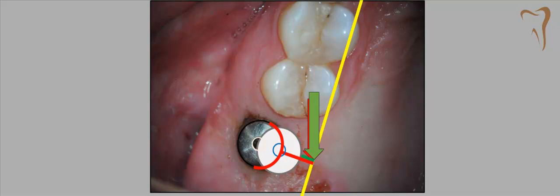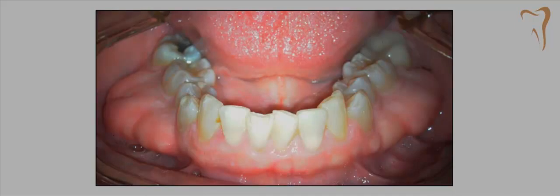So I don't think this is my research here. But when you look at it and you put the implant back into the middle of the ridge and you put the force vectors on that one, you can see the difference will be probably half as much. Okay, so look at Maureen from the front and look at the frontal view and look at how much bone she's actually built in these tori. She's massively built bone, and so she's really a candidate. You know, all the signs are there of massive function on these teeth.